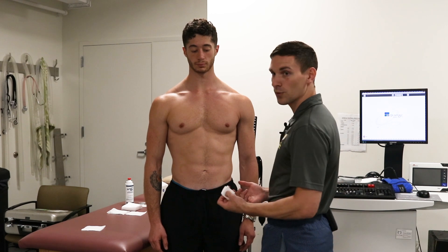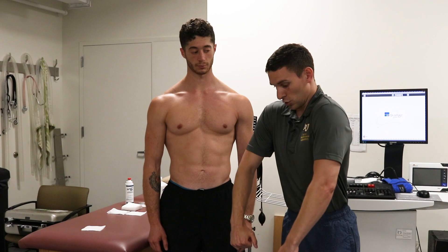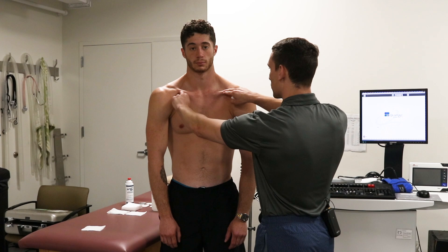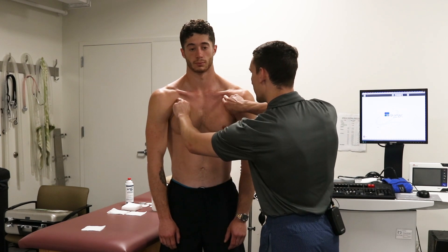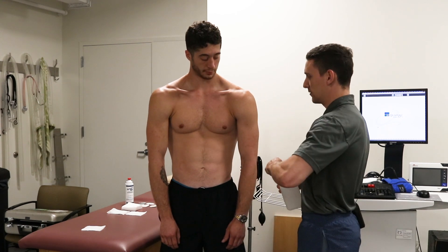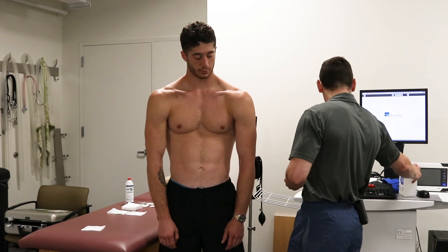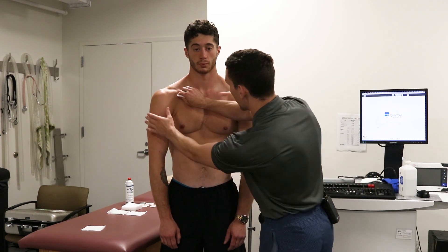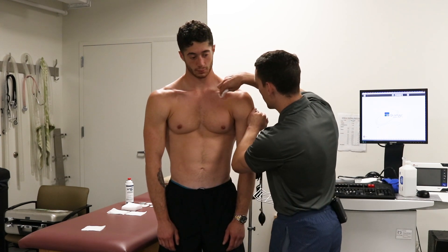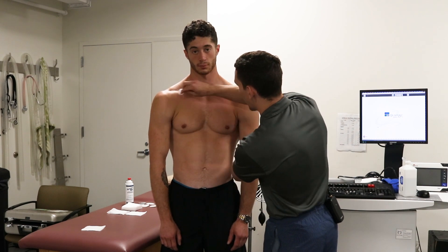The first ones we're going to look at are the right and the left arms. We're going to have him shrug up until we can see his clavicles pop out. We're going to go to the very end top corners of his clavicles. We'll take our alcohol and our gauze pad and wipe those areas down, palpating one spot, two spot, and then take the clean side and brush off that alcohol.